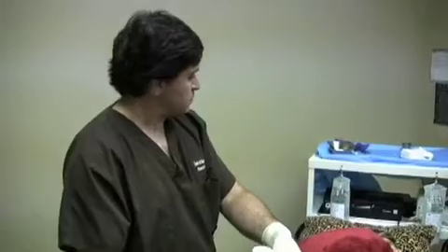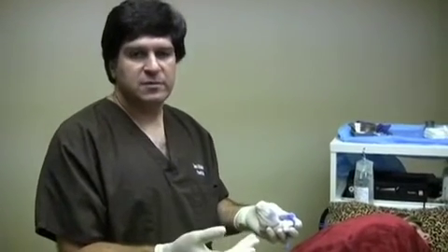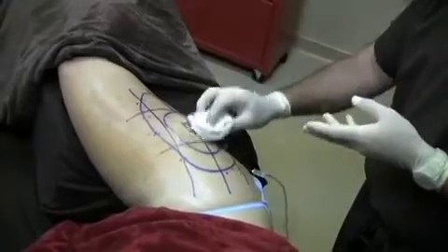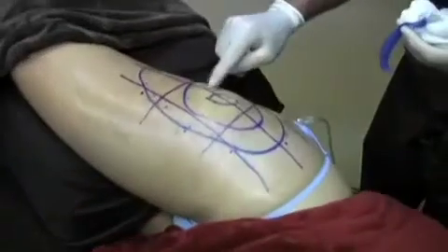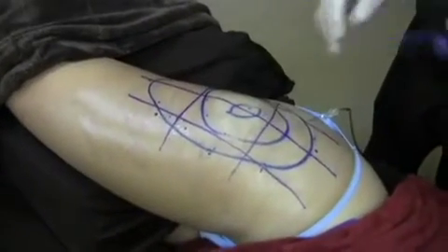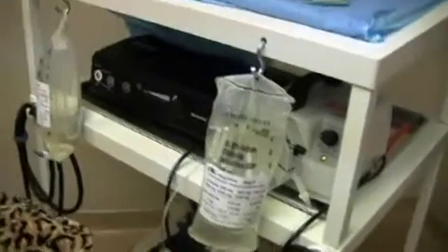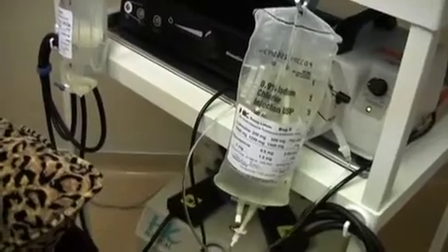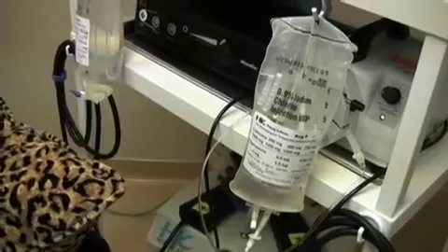How long of a procedure overall will this be? Well, this could be 2 to 3 hours. It does take longer than if you put a patient to sleep, but I think that the benefits outweigh the increased length of time from general anesthesia. And you can see that she's already starting to get white where I've infiltrated in the middle there. Is that from pressure? That's vasoconstriction, as well as from pressure. So does this entire bag go in? Yes, I will put the entire bag in per area that I'm doing, and we're doing 4 different areas. So we have 4 bags.